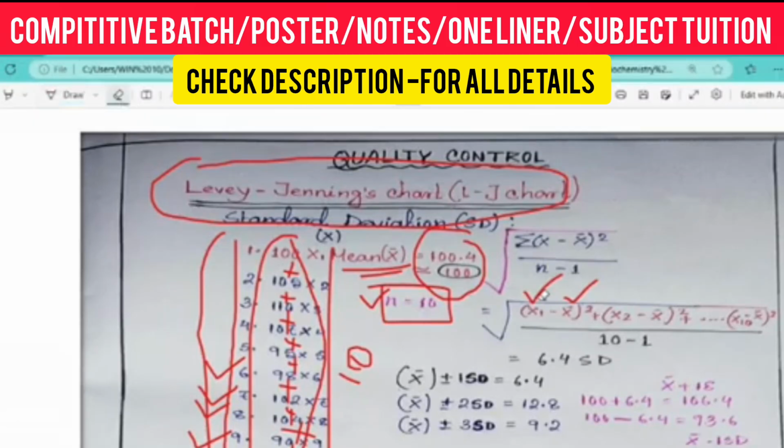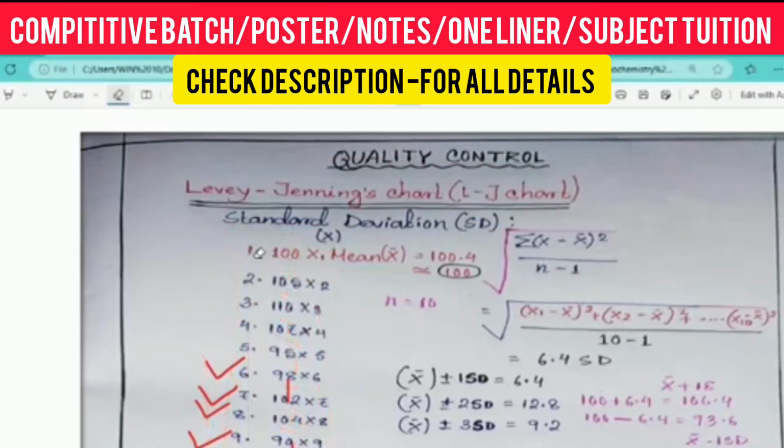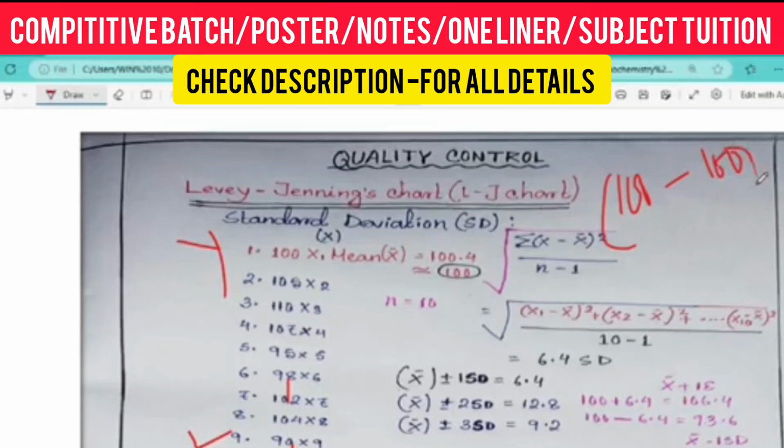So if I am doing the calculation here, it should be like that. What will be the x1? 100. So x1 is 100, minus x bar, which is 100, whole squared, plus, I am just giving two examples, after that you can easily calculate. Next, what will be x2? 105. So 105 minus 100, whole squared, plus x3 minus 100, like that. Are you understanding how it's happening?